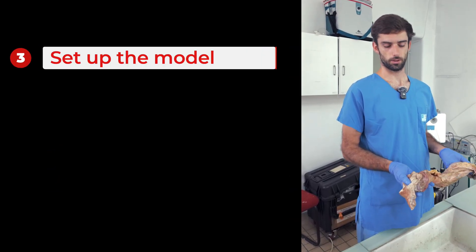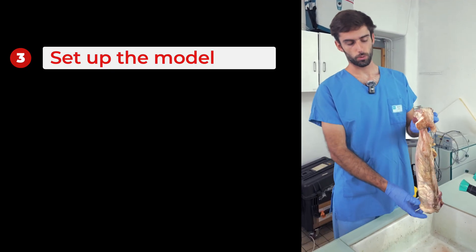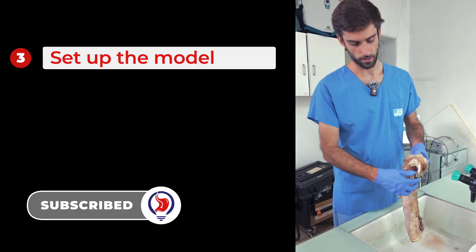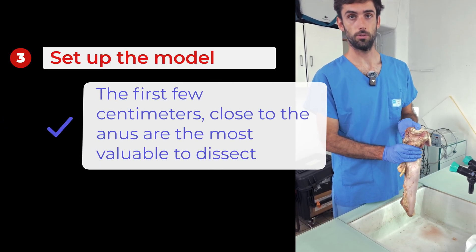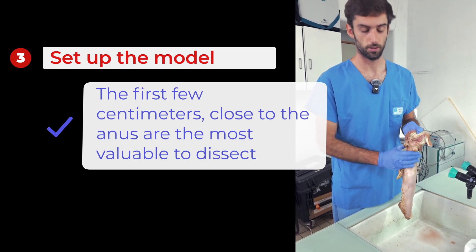Here is the piece of cow colon and rectum that I went to get at the slaughterhouse and that we are going to use. You can see that this corresponds to roughly the last 50 centimeters from the anus. Here you can see the anal end, which can be identified by the external sphincters and the skin. This is an important part to recover because the first few centimeters beyond the anus are the most interesting to dissect, as they most closely resemble what can be found in humans.